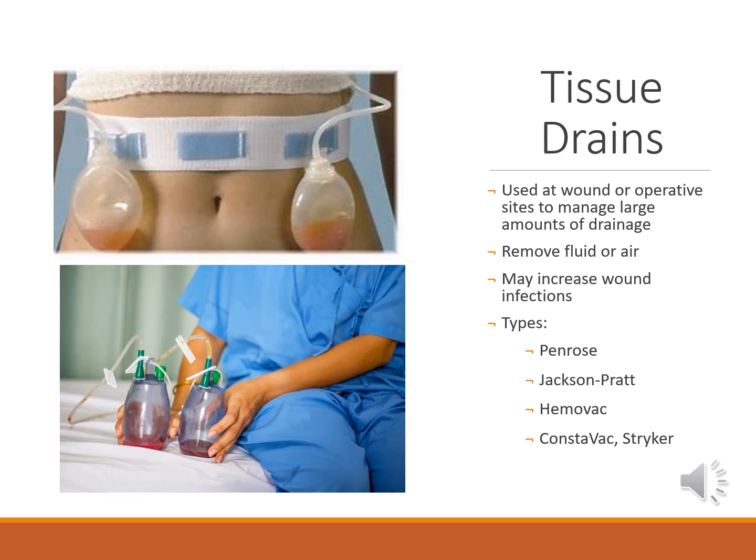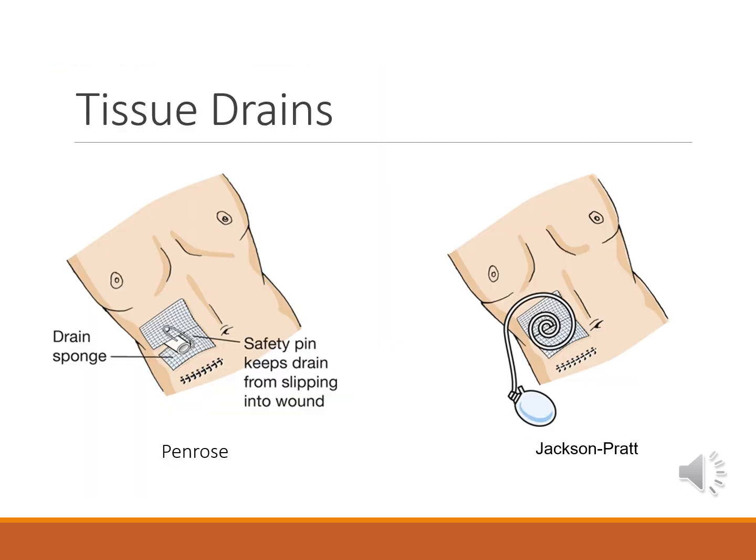When imaging a patient with a drain, use surgical aseptic techniques if touching the area to prevent introducing new microorganisms into the wound. A Penrose tissue drain uses a soft rubber tube resembling a tourniquet that allows drainage to flow freely out of the tube. These are typically used for superficial wounds or abscess drainages.